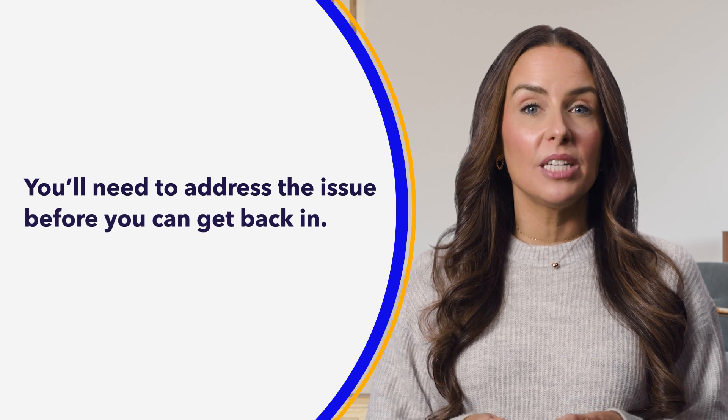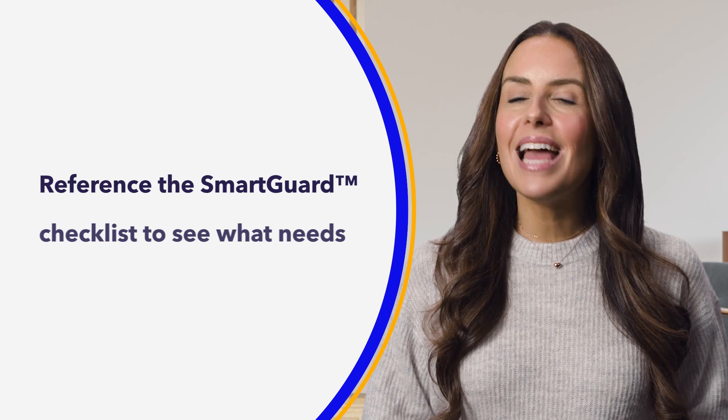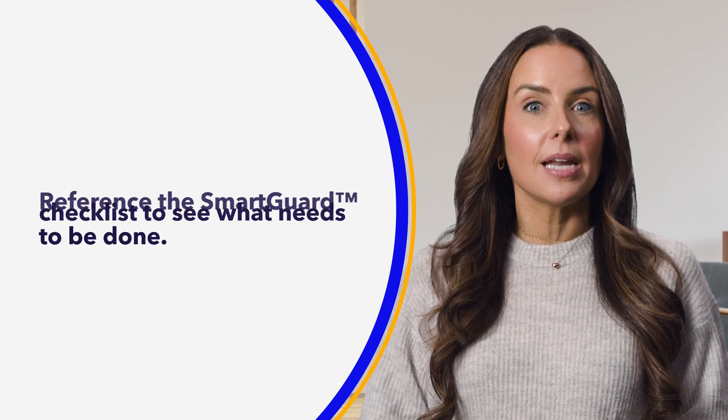If any of these happen and you experience an exit, you'll need to address the condition that caused the exit before you can get back in. If you have any trouble at all, remember to check the SmartGuard Checklist screen to see what actually needs to be done. That's it for our look at the SmartGuard feature.